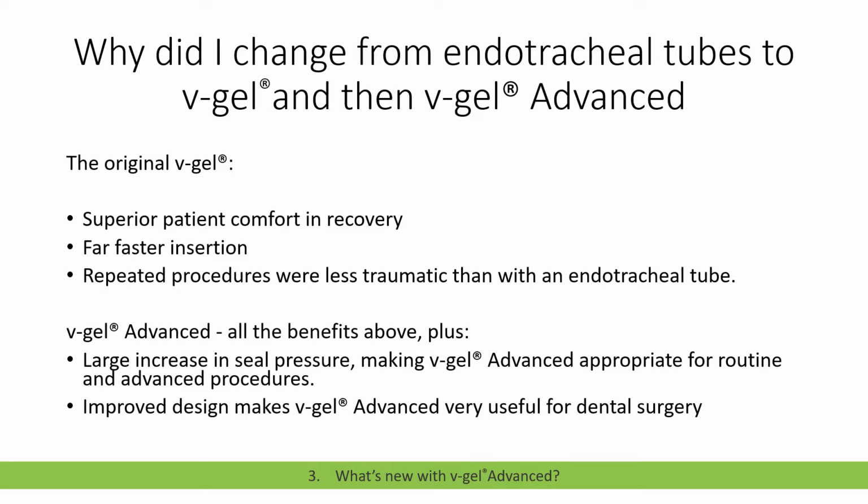And that improved design for dental surgery, that's quite a big deal. It means that you've got more space to work, you can move instruments around, you can visualize the teeth much more easily, and the device itself is a little more flexible than the original VGels, so you can displace it around the mouth more easily without worrying about displacing it from the airway.